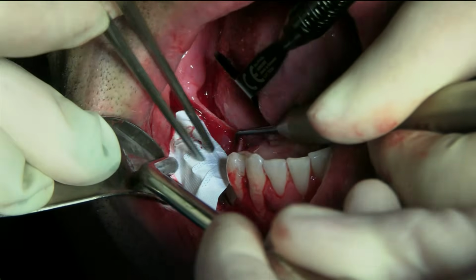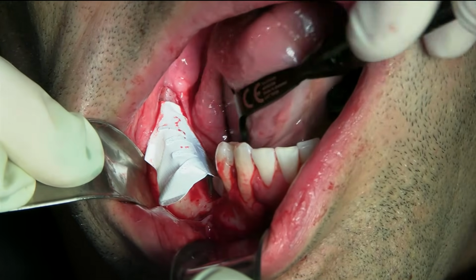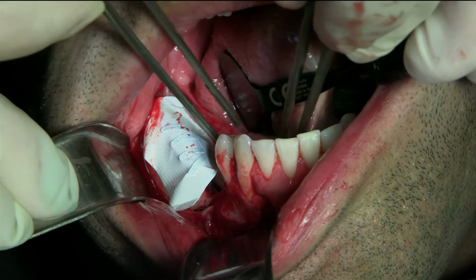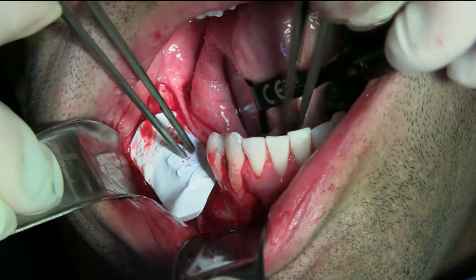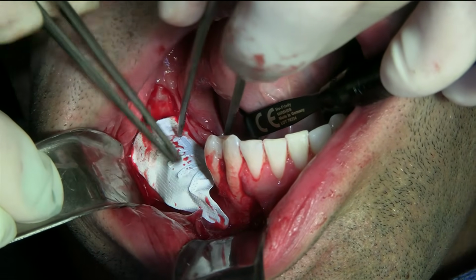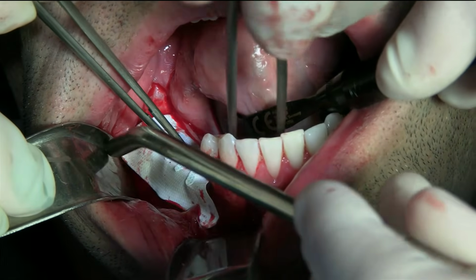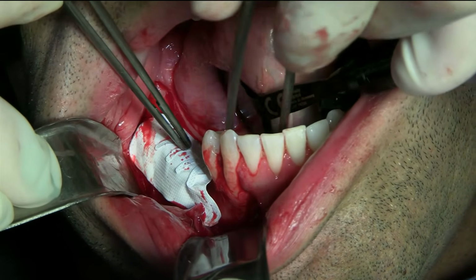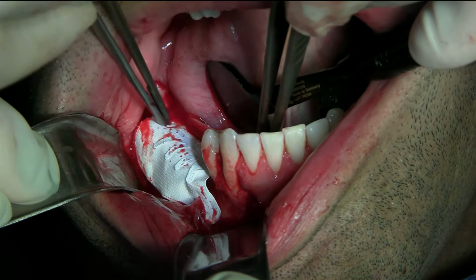Now the distal seems good, so the length is perfect. So if I can move it like this, and then we can put this one here. So I like the position of the membrane, so my eyeball visualization and knowing these kind of defects works for me. So I'm okay. So now it's just a matter of how do I get a screw in here.